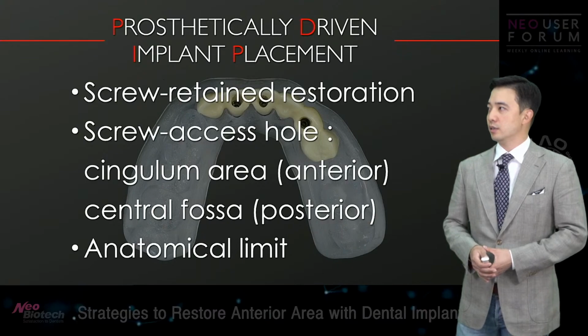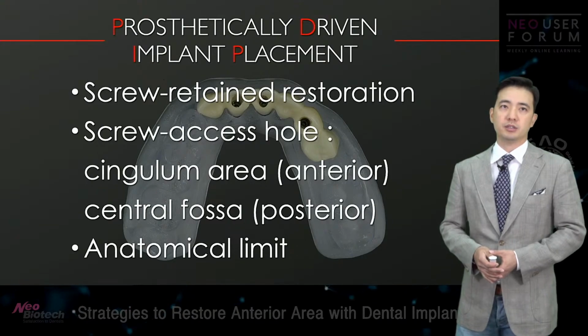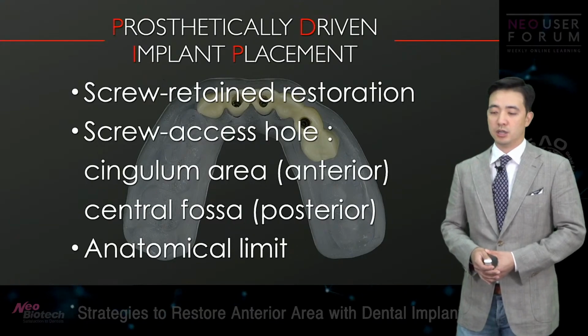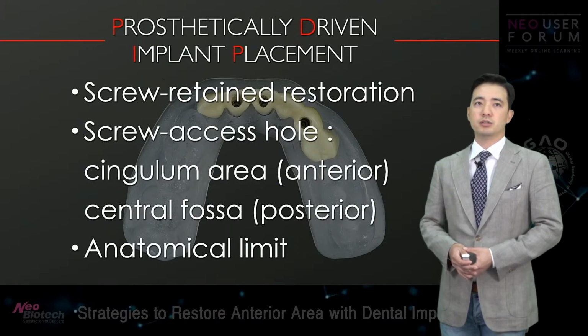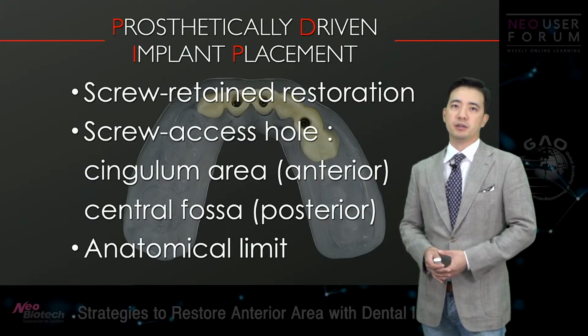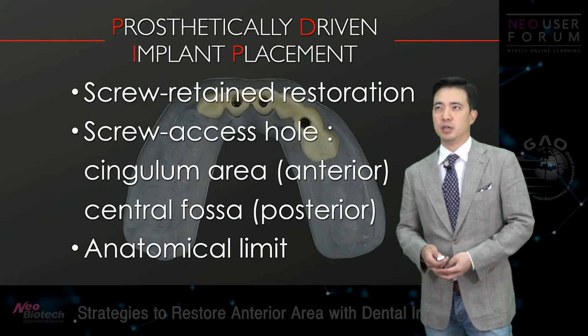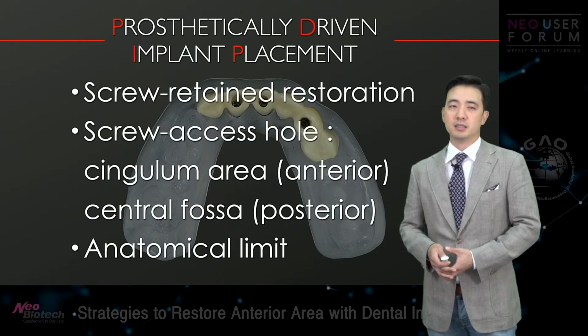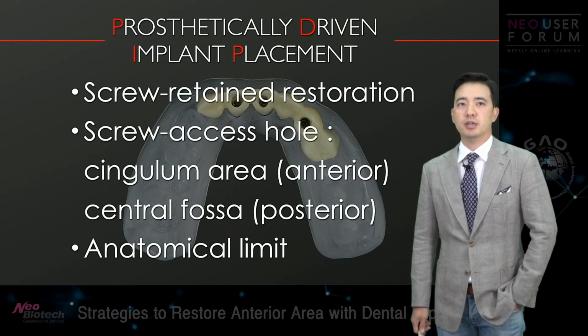For example, in most cases I think we all agree that screw retained restorations are more favorable because they have better maintenance compared to cement retained restorations.